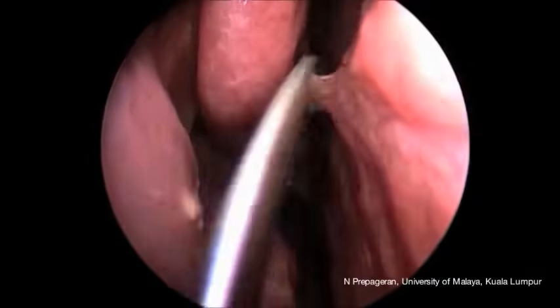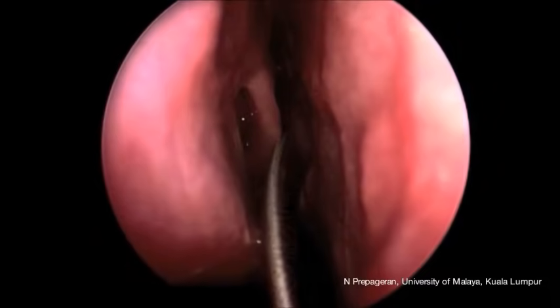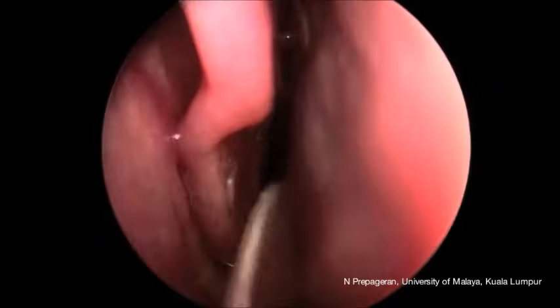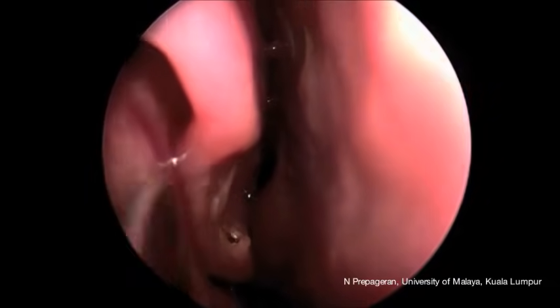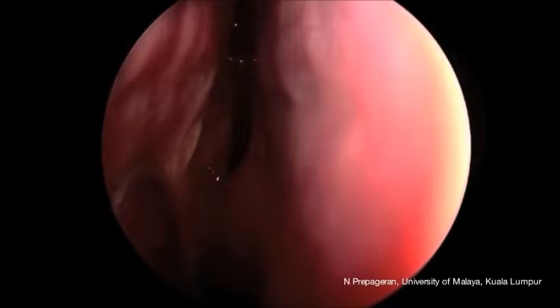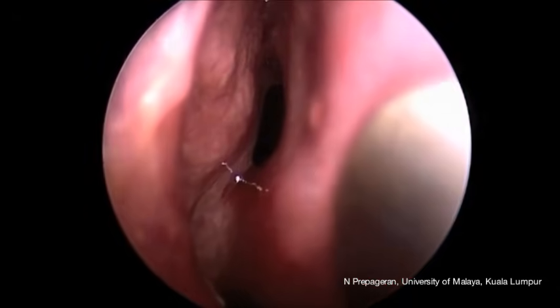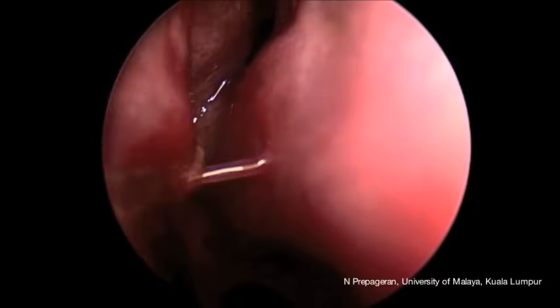We are visualizing the middle turbinate and we gently displace it laterally, which shows us the superior turbinate. To find the sphenoid ostia, we gently push the superior turbinate laterally, going between the septum and the superior turbinate. There you can see the sphenoostia. This is the superior turbinate recess where the posterior ethmoid drains. Going medially between the septum and superior turbinate leads you straight to the sphenoid ostia.